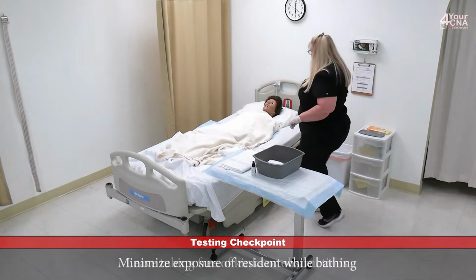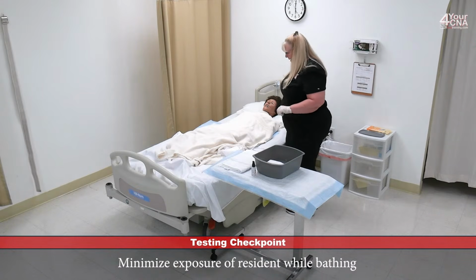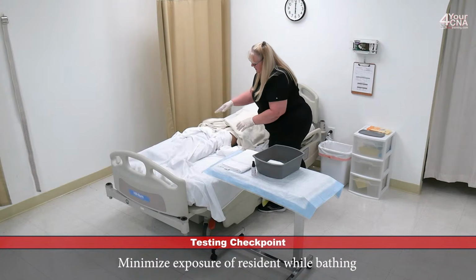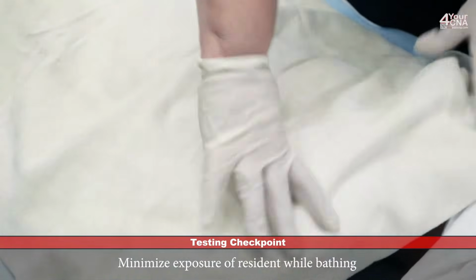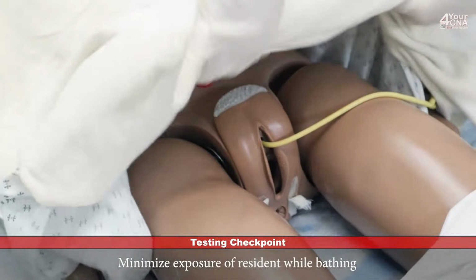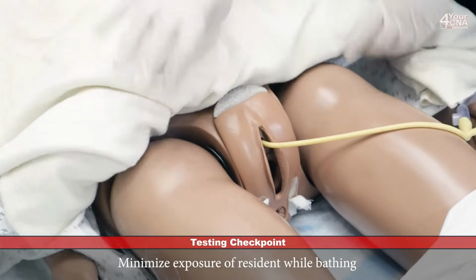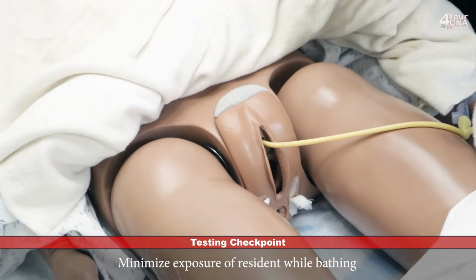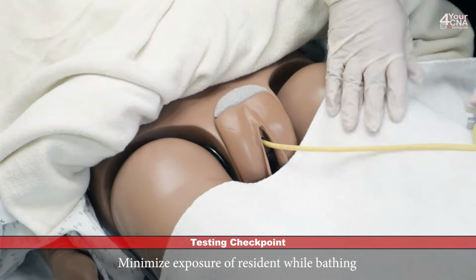Miss Jones, I'm going to expose you. I'll make this as brief as possible, but please let me know if you're uncomfortable in any way. I'm going to roll the privacy blanket, making sure that I get the gown inside the blanket as I roll it. But I don't want to grab that catheter as I'm rolling the blanket. So you want to be very gentle with this process. This is going to expose the peri area. And then I'll place a towel over the upper thighs and make sure that the catheter tubing is on the towel.